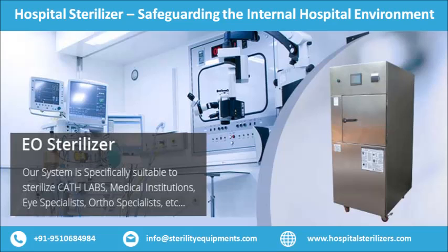It is therefore commonly used to sterilize instruments with long tubes like endoscopes and all materials that cannot be sterilized by steam. EO sterilization machines are operated at a temperature of 25 to 55 degrees Celsius. A lower temperature will eventually lead to longer exposure time, making the process less efficient.